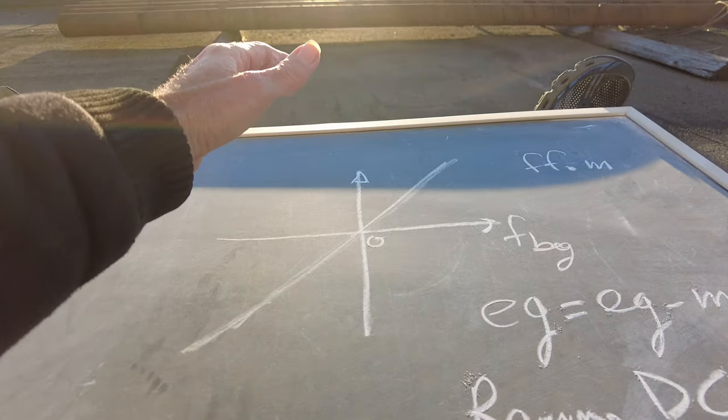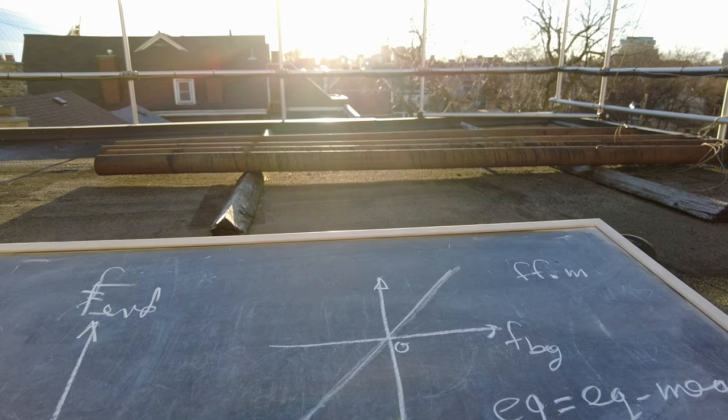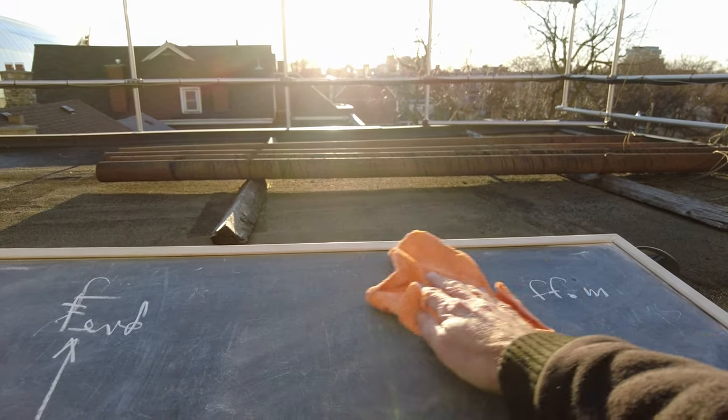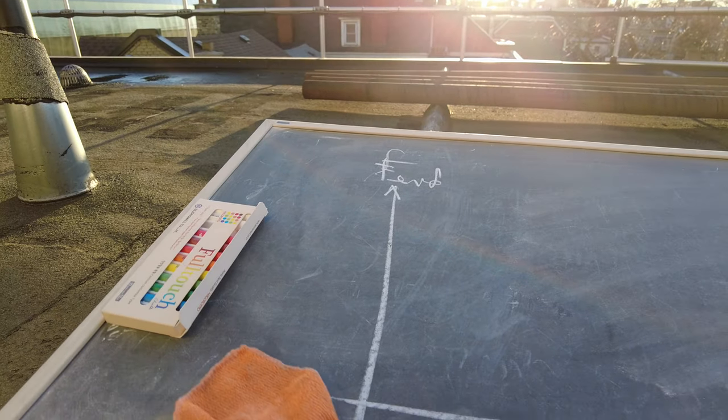So a lot of times I like to just get rid of that origin, just blow away the origin. So many times I take the DC offset out. And now we're looking at the ECG, the electrocardiogram.